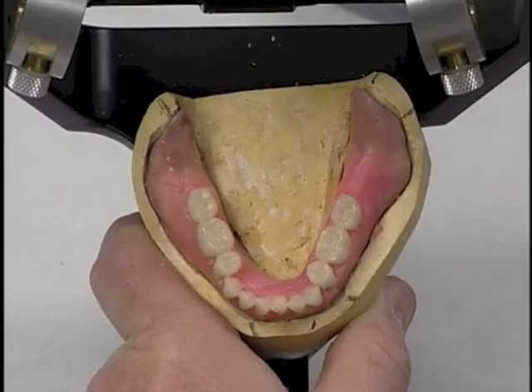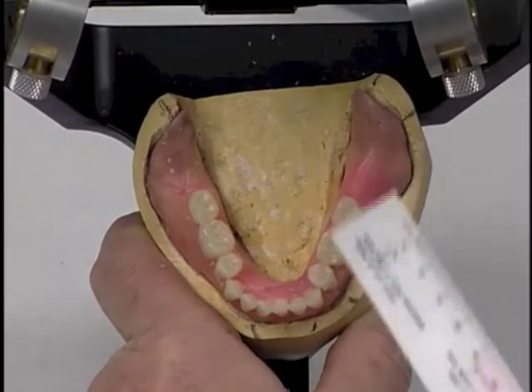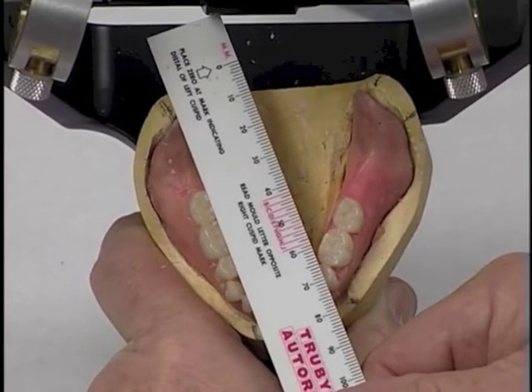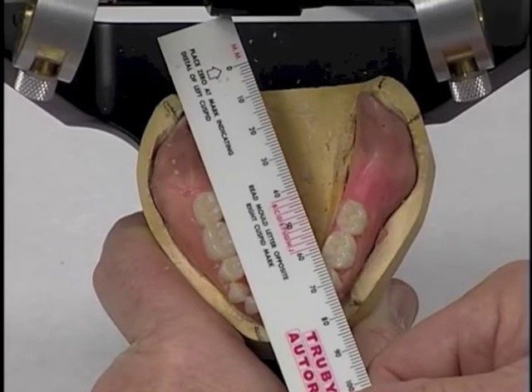Now that we've arranged the mandibular posterior teeth, we want to check and see if they meet the criteria that we've laid out. First of all, we wanted the central grooves to be over the crest of the ridge, and we marked the crest of the ridge, so let's see. And yes, if we line that up now, the mark that we placed back with the retromolar pad and the anterior mark, we see that the central grooves of those teeth are over the crest of the ridge.